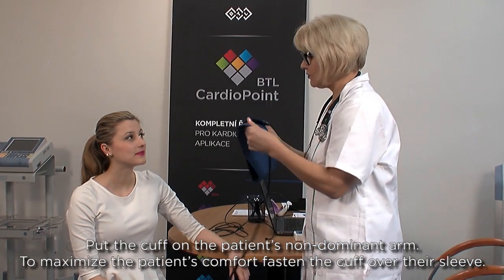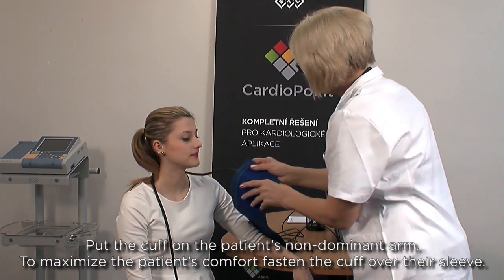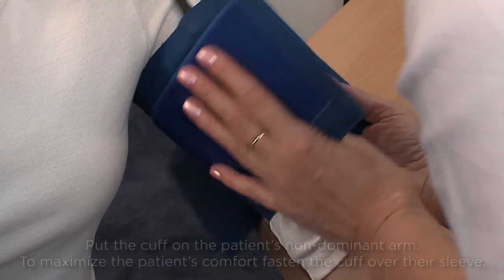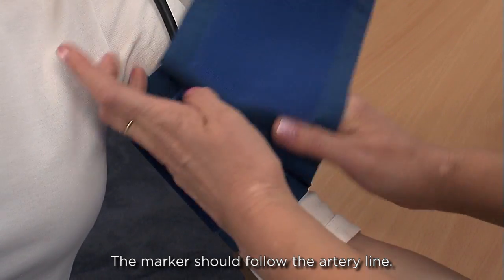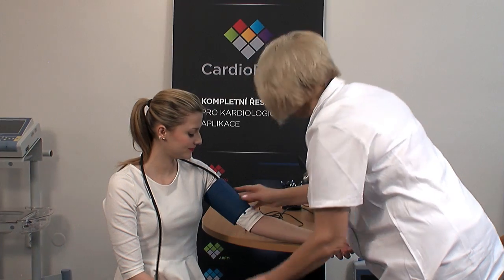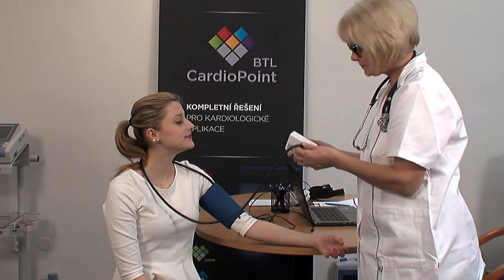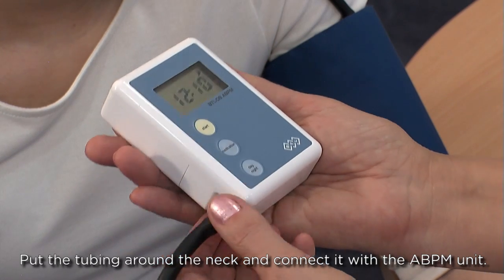Now put the cuff on the patient's non-dominant arm. To maximize the patient's comfort, fasten the cuff over their sleeve. The marker should follow the artery line. Put the tubing round the neck and connect it with the ABPM unit.